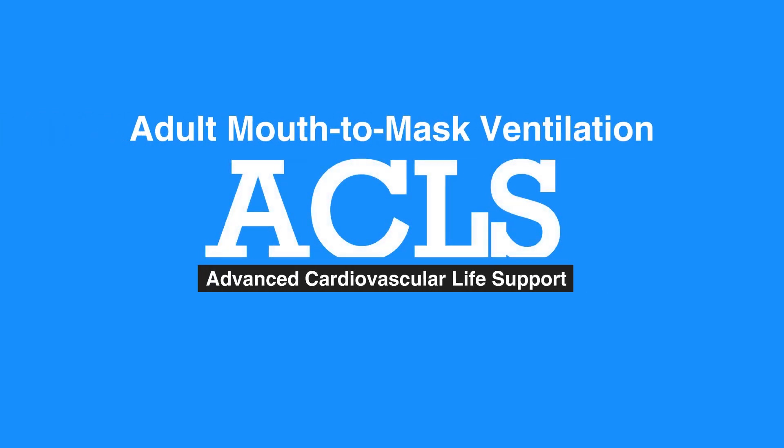Welcome to the Adult Mouth-to-Mask Ventilation. In this video, we will discuss the use of a mask to deliver breaths in one-rescuer CPR.